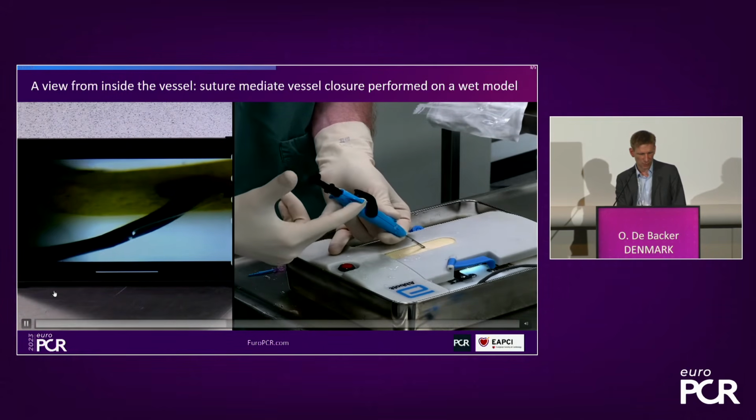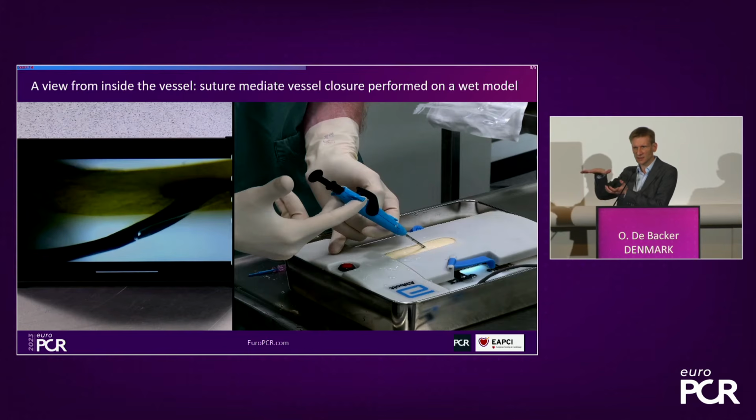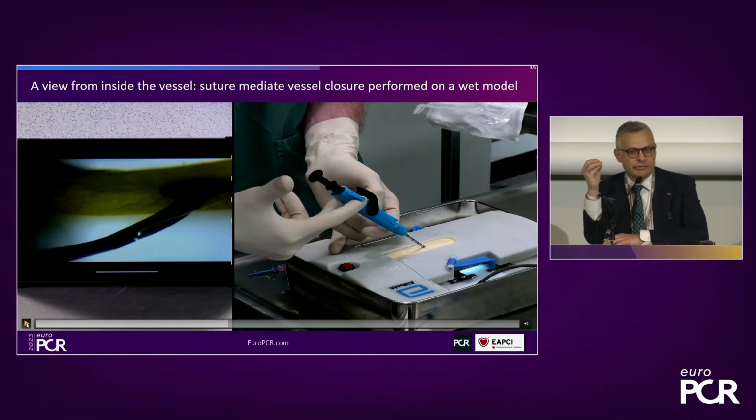That's why it's important, I will pause it here, when you do this traction, we put two fingers here behind to pull back on the ProStyle, and you see this is a nice 45-degree angle. That's why it has to be a nice 45 degrees, because then this anchor that came out intravascularly nicely is parallel with the vessel wall. I think that's what you wanted to show, yes, Francesco? Yeah, I think it's very important to remember this. 45 degrees is the angle of that lever.